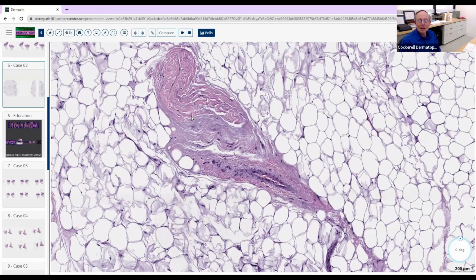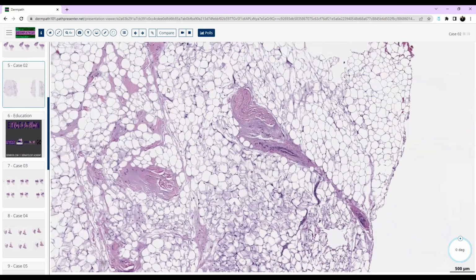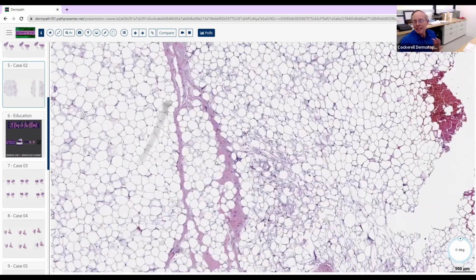If they showed you something, they might show you something like a pleomorphic lipoma or an angiolipoma, or a combination of an angiolipoma with some areas that almost look like smooth muscle involvement, and they might say this is an angiomyolipoma, and what syndrome is that associated with? I'm sure you know the answer to that. Oh, I actually don't. Tuberous sclerosis, you get renal angiomyolipoma.